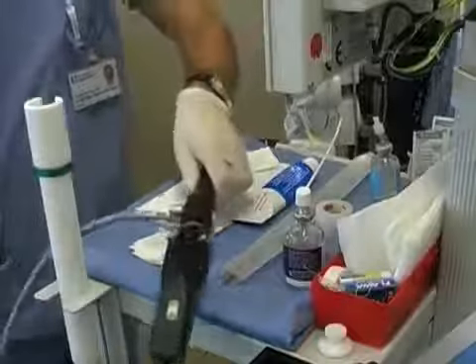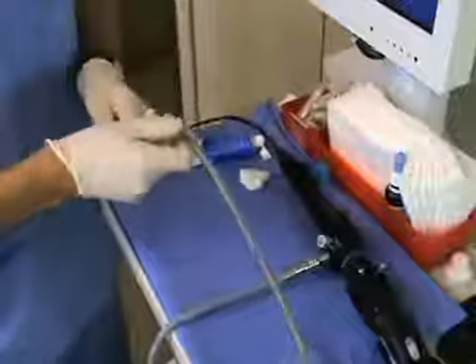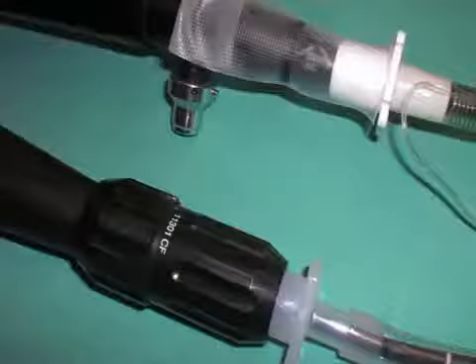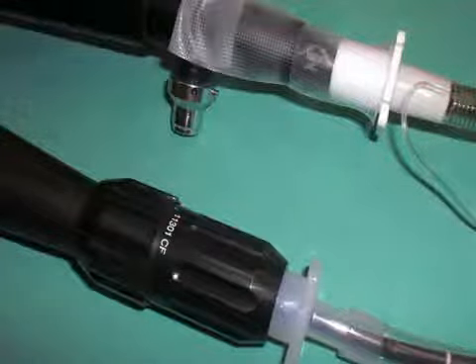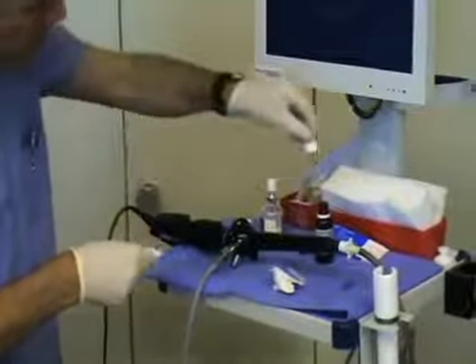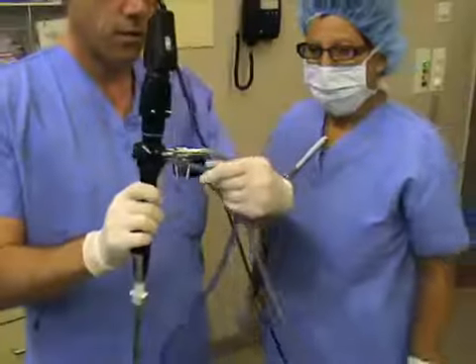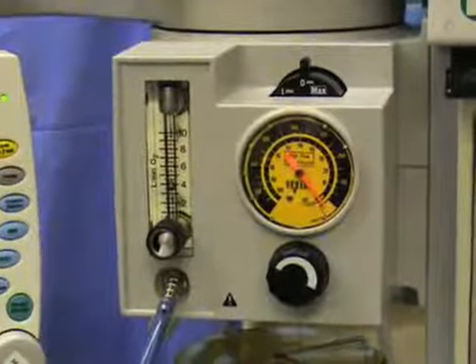While you are preparing the equipment, be sure to oxygenate the patient adequately with a firmly applied mask. Thread the tube over the lubricated fibroscope and fix it with tape or with the appropriate adapter to the fibroscope. Check to ensure that the fibroscope is flexible and provides a focused view, and then apply an anti-fogging agent to the tip of the scope. Connect oxygen to the fibroscope and provide 2 to 4 liters of oxygen per minute continuously.